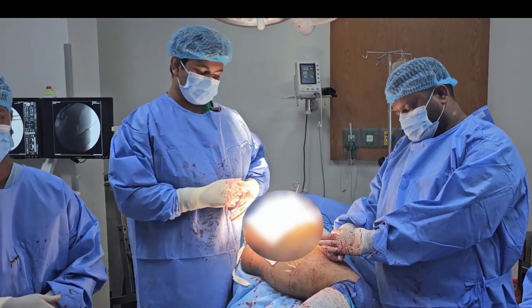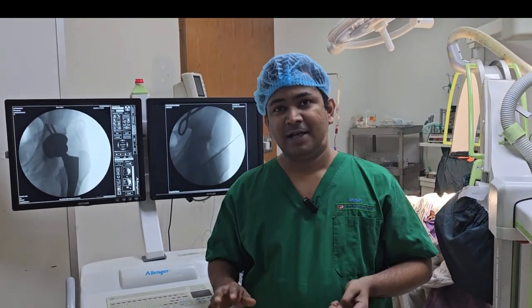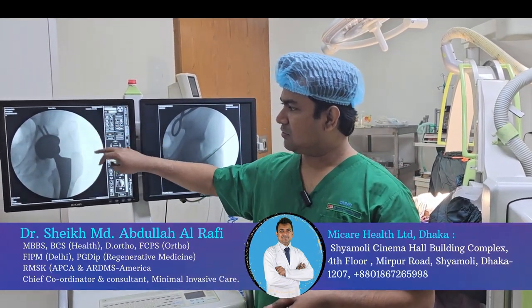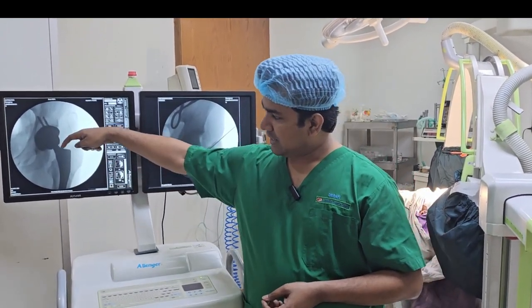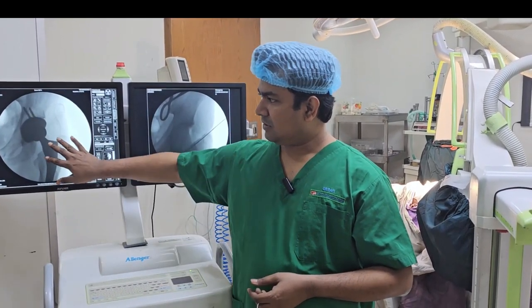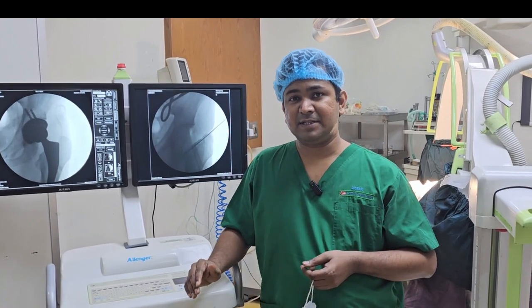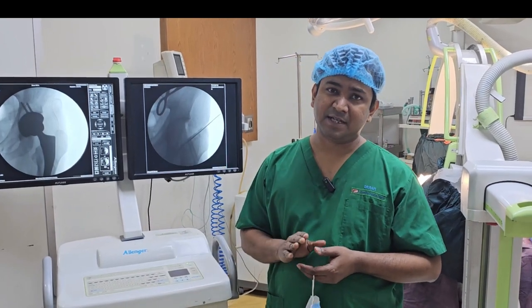We have done this very successfully — bilateral total hip replacement. This is the immediate post-operative fluoroscopy showing excellent placement of the femoral stem and acetabular cap. All portions and profiles are fantastically aligned.